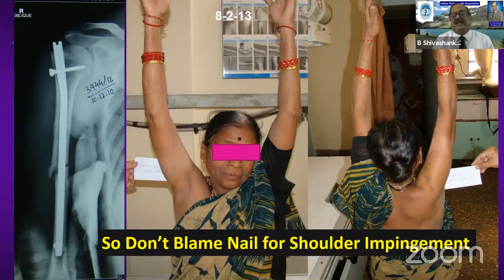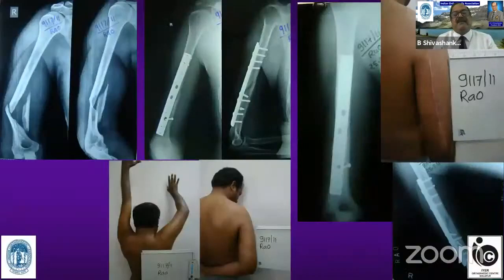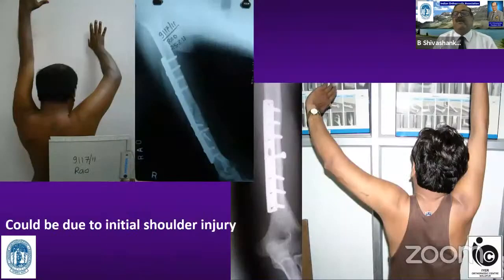They don't do active physiotherapy in the post-operative period. That could lead to stiffness, or it could be due to the initial injury itself. See, this was a case of plating done elsewhere. The patient came to me for stitch removal and further follow-up. So this patient also has a stiffness of the shoulder. It could be due to the injury itself. So don't blame the nail only for shoulder stiffness. This is what I want to tell.